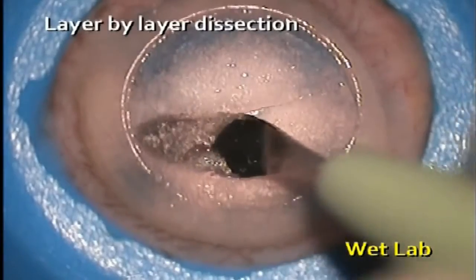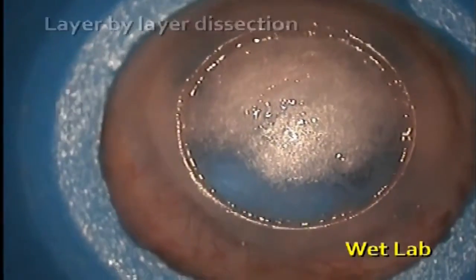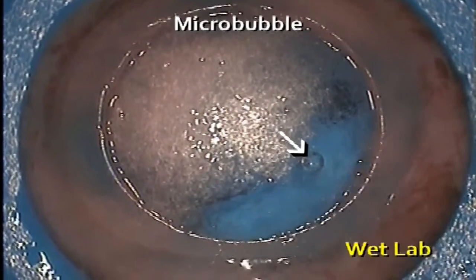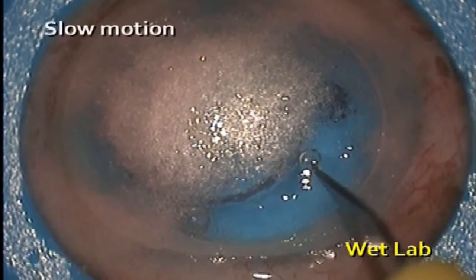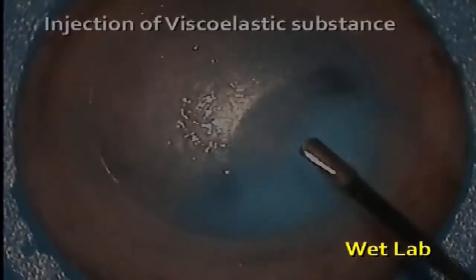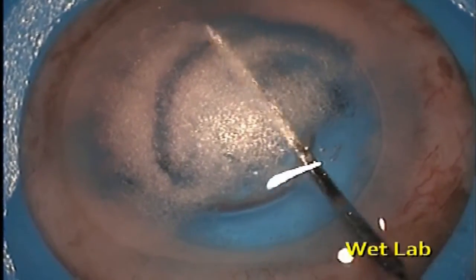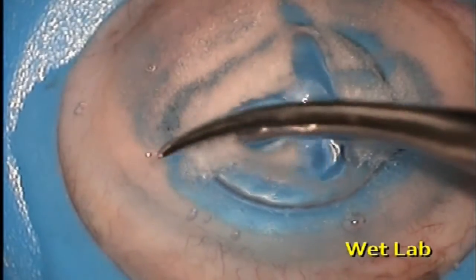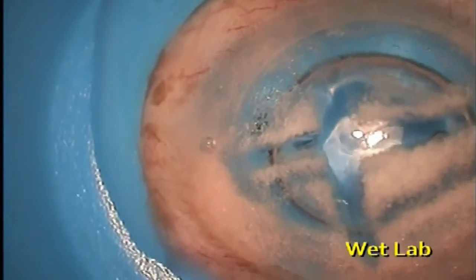We picked a failed-bubble cornea and carried out a layer-by-layer dissection. The microbubble nearest to the Descemet was identified and punctured. A viscoelastic substance was then injected, successfully separating the Descemet from the rest of the stroma. The remaining surgical steps are similar to a routine DALK procedure.